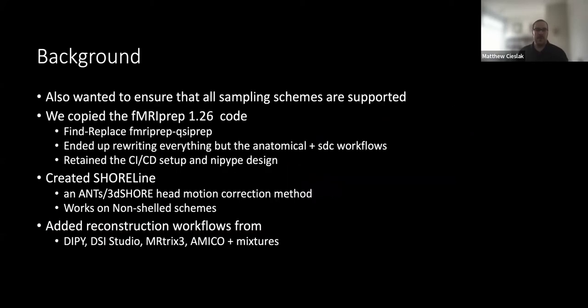One of the other big motivations for us is we wanted to make sure that all sampling schemes are supported.